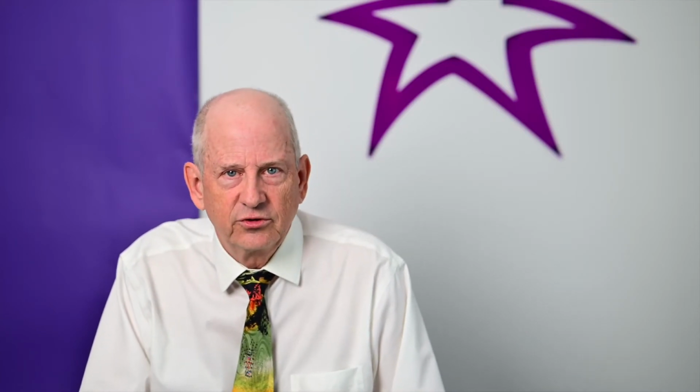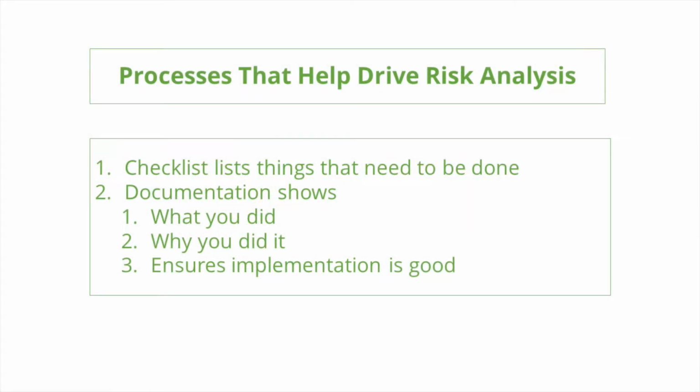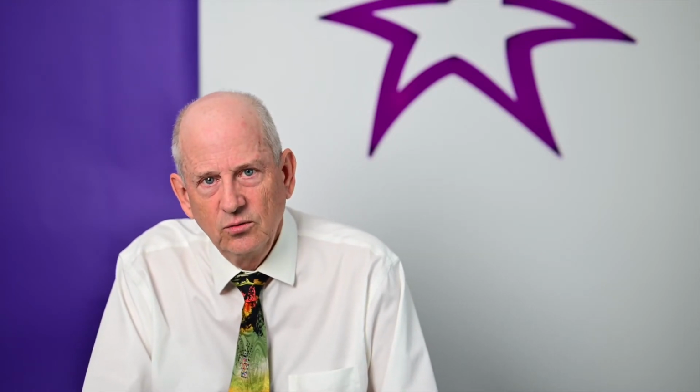Key part of getting this right is ensuring that all members of the software development team are involved in the risk analysis, understanding the risks of the device, and also understanding how the risks apply to the different software items. Processes are a key part of ensuring that the right things are done and are seen to be done. They help drive the risk analysis, what needs to be done there, how the implementation is done, and how things are verified later on. The checklist provides the things that need to be done and the documentation that needs to be produced so that outside bodies can see what you did and why and ensure the implementation was good.